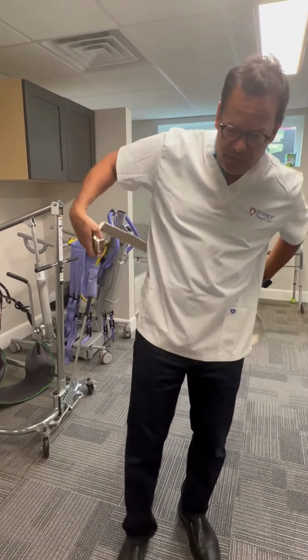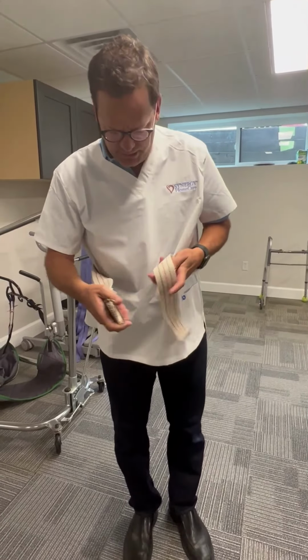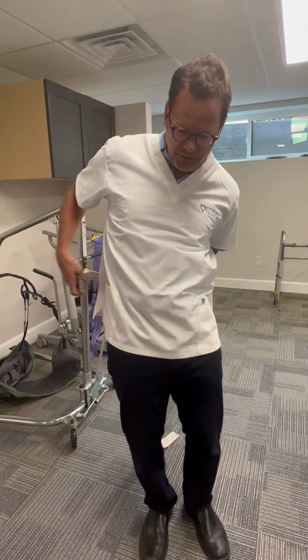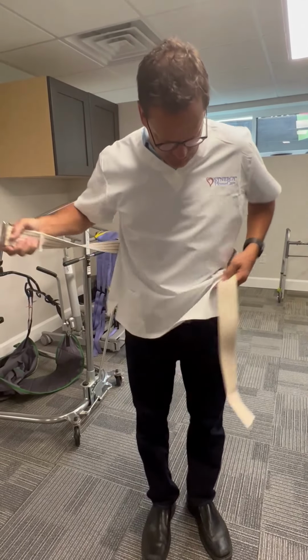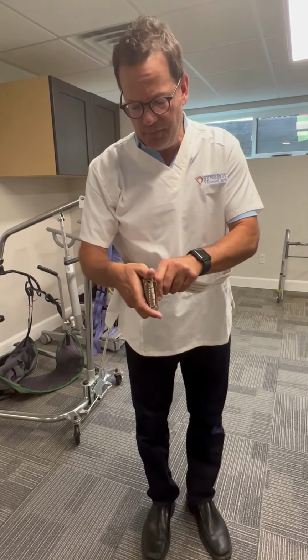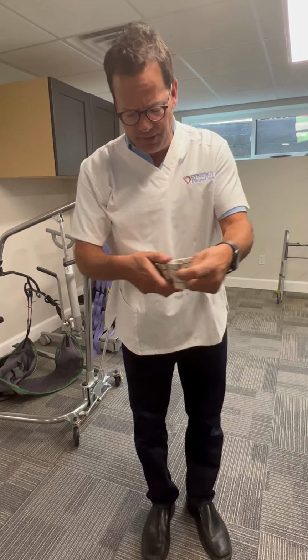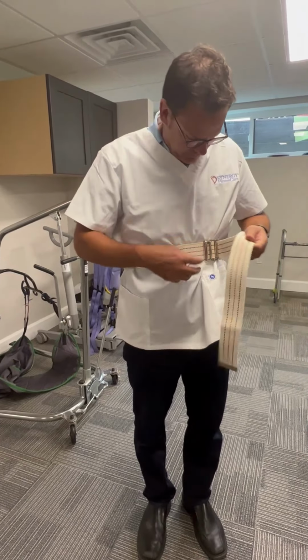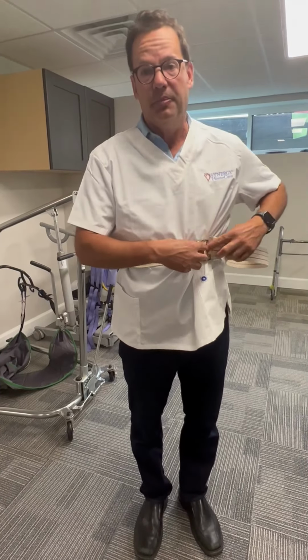When we place a gait belt on a client, we place it right below the ribs. The very most important element of a gait belt is that it is firm.